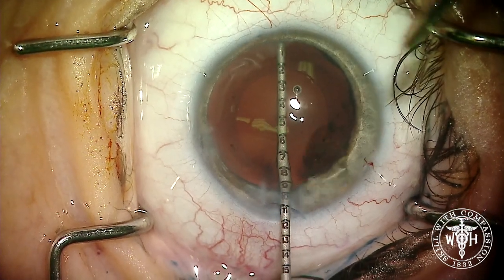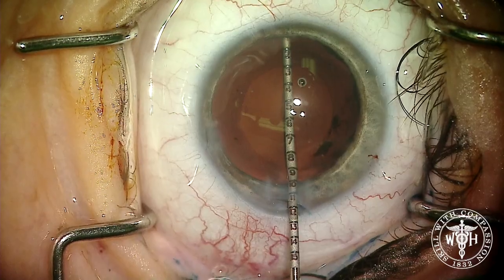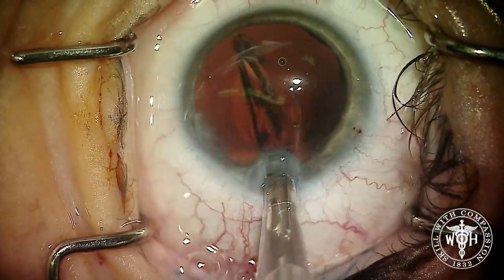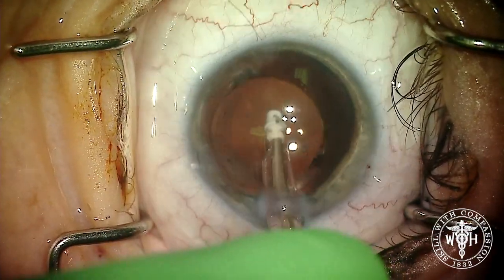There was no zonular dehiscence in this case. Using the intraocular ruler to carefully measure the size of the capsular bag helps determine how large to trim the HumanOptics artificial iris, which is made of silicone in this case.